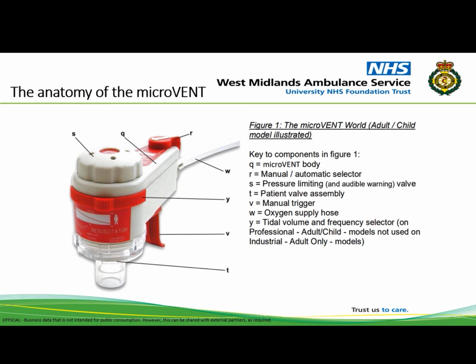The trust is recommending that a bag valve mask should be utilised when considering manually ventilating a patient, and to only use the ventilator for patients requiring intermittent positive pressure ventilation by the cycle system within this ventilator.